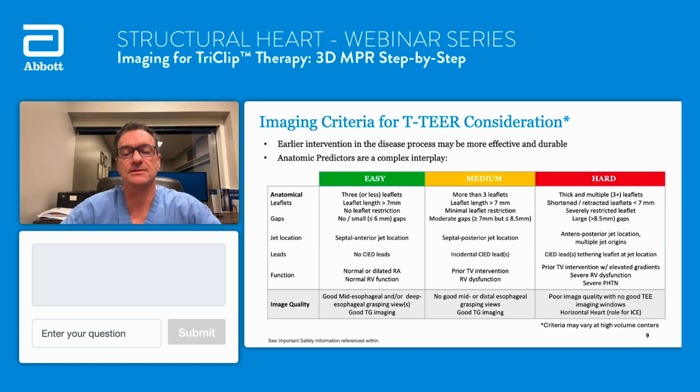So one of the things to consider in general when you're approaching a patient and you've got the imaging is this concept of relatively easy cases, the medium cases, and what will be considered a hard case, and for some centers an undoable case, or a case you don't want to tackle without significant experience.